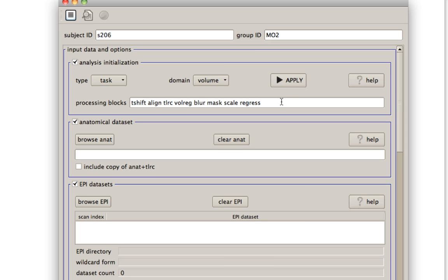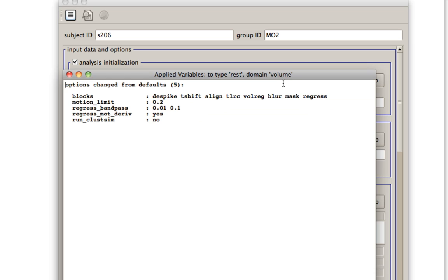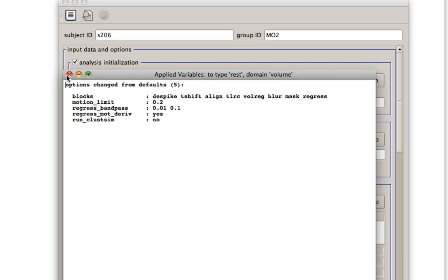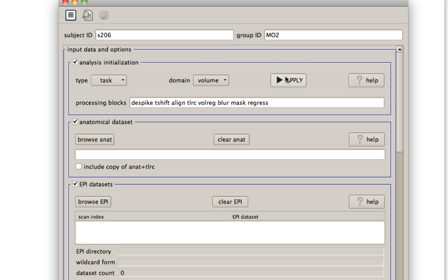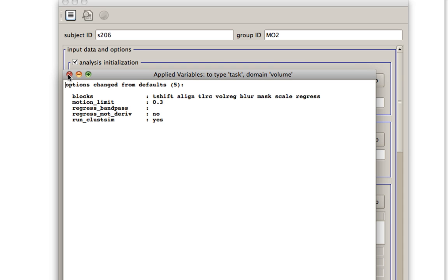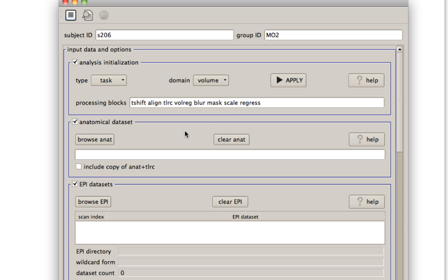Relatively recently, they've added this analysis initialization option. Now, if you're doing a resting state, you can do that and then apply those steps. It'll be slightly different than if you do a typical task-based fMRI dataset analysis. Notice you can also do this for surface-based analysis if you wish.